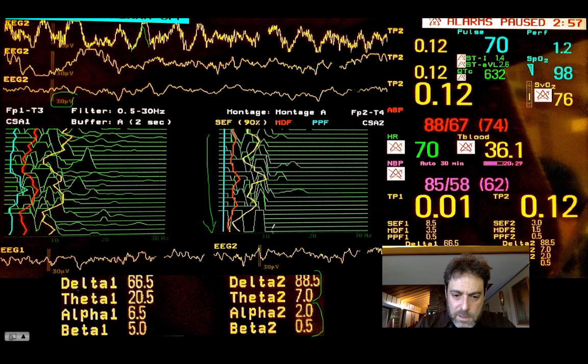This is 10 hertz, 20 hertz, and 30 hertz. So we've got virtually no activity over time. Every one of these I think is 2 seconds going backwards. So we have some blips over here in the beta range, but most commonly all of our frequencies are below 10 hertz.